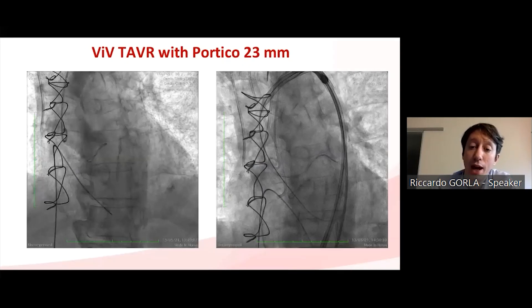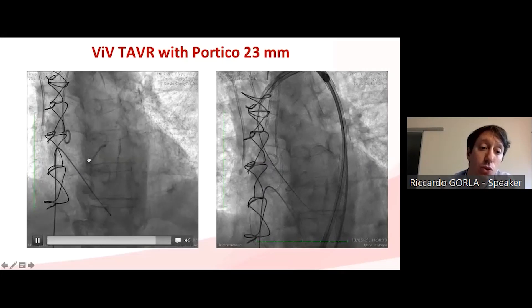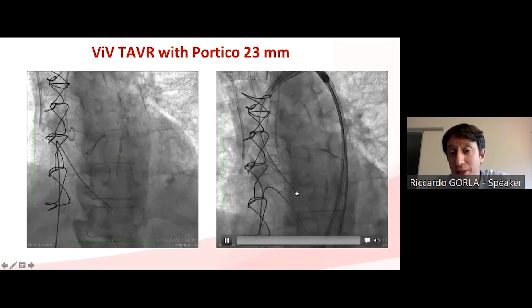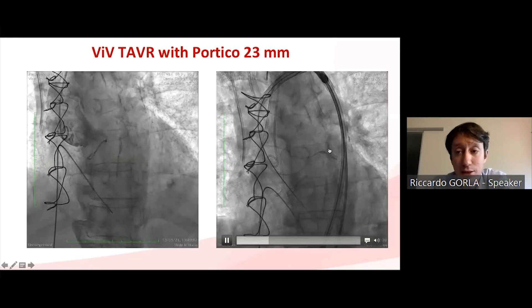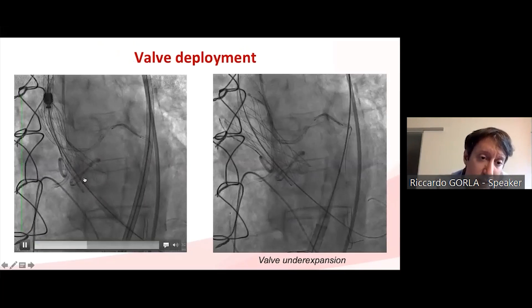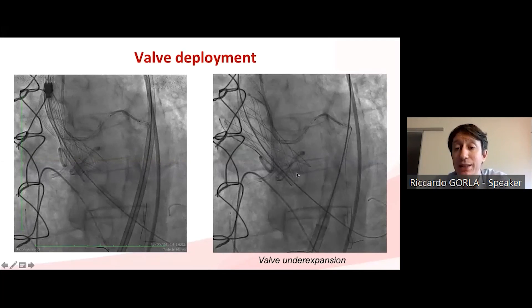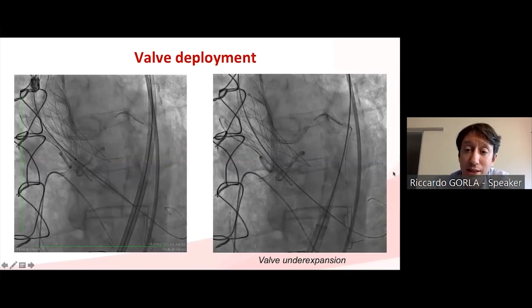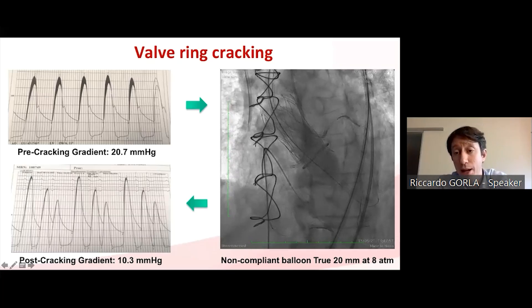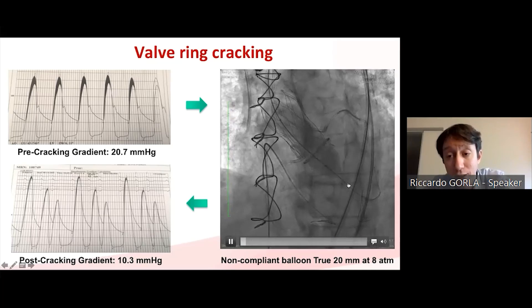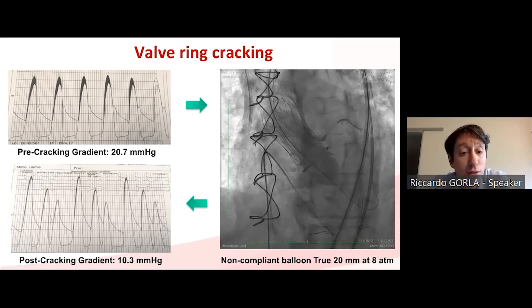The procedure begins with a basal angiogram in three-cusp coplanar view with adjustment to align the sewing ring. Before crossing the valve with the Portico, we intubated both the left main and RCA and placed two stents in the proximal segments of the coronary arteries. After valve release, the Portico 23 is seen to be severely underexpanded, so we decided to perform valve ring fracture. The pre-cracking gradient was more than 20 mmHg. We used a non-compliant true 20mm balloon at 8 atmospheres and successfully cracked the sewing ring of the Mitraflow.